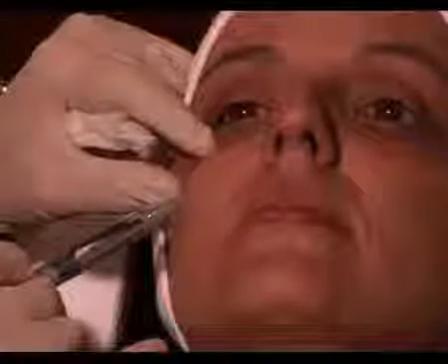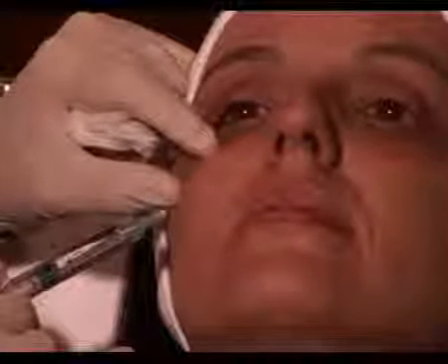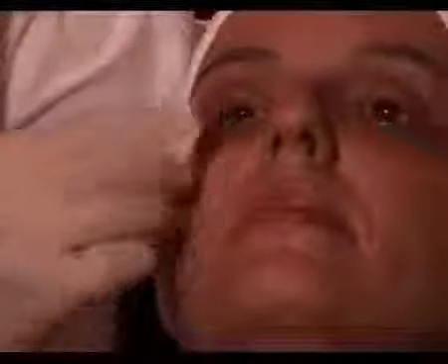This is known as anterograde. I'm injecting a little bit more into that area, and then I'm going to slowly start coming out in a retrograde fashion. I've injected about 1 cc now of the Ultimate, and you can see an immediate effect happening right now.